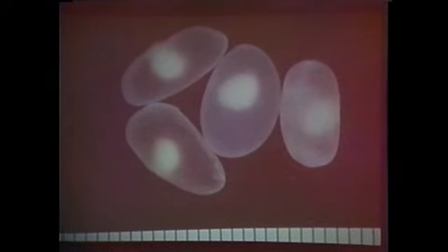Cysticercoids are very, very rare, as opposed to cysticerci, which all of you know, you never miss the diagnosis. It is a balloon which has one scolex, or one neck, with a rostellum. And here is the bladder. Here is the neck. And those black things you will find later to be calcareous corpuscles. Remember, the thing that nobody else has. All right, there they are. And sometimes you have hooks on the rostellum. It is armed, and sometimes you don't.